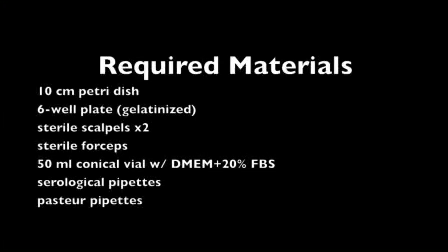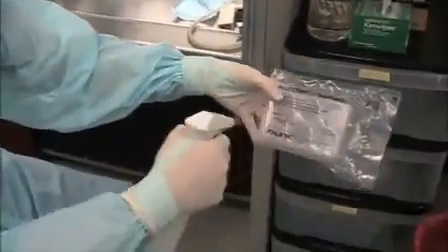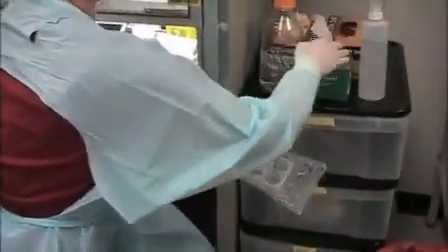Hello, welcome to the Skin Biopsy Processing video tutorial. Start by placing the required materials in the tissue culture hood. All objects entering the hood must be sprayed with 70% ethanol and wiped down.